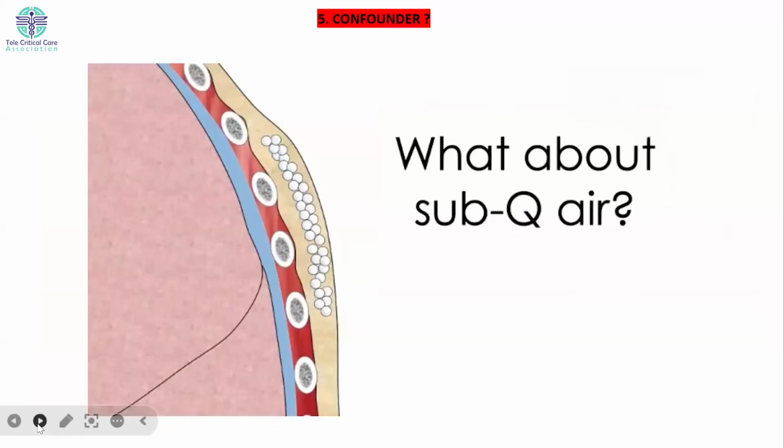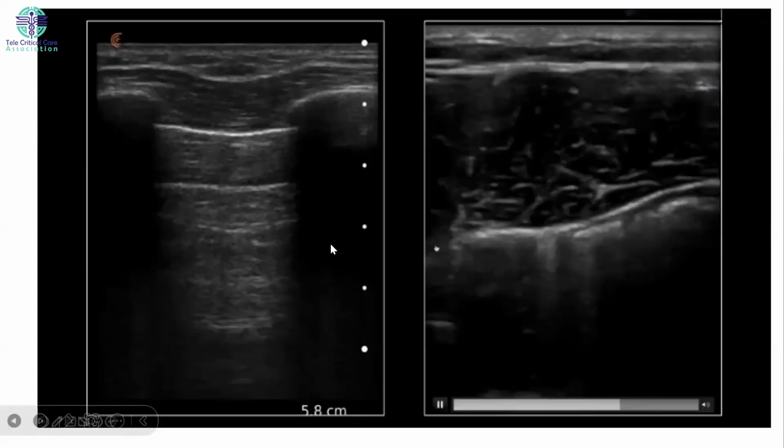Now, what about subcutaneous air? Suppose there's subcutaneous air and you put your linear probe on this subcutaneous air to visualize the pneumothorax, you will find that the visceral pleura and parietal pleura are not moving, because this is confounded by the presence of subcutaneous air. There is almost always a case that if there is subcutaneous air, there should be pneumothorax, but it is not always true, right? So even if the patient doesn't have pneumothorax, you will falsely diagnose it as a pneumothorax if there's subcutaneous air. Right? So this is a normal patient, and this is the subcutaneous air which is present.